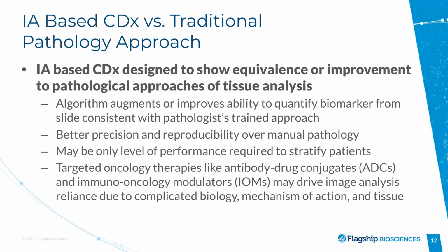Traditional pathologists don't really do as good a job as in the diagnostic work. Hence, in this era of personalized medicine, digital image analysis comes true. In truth, though, we have to keep in mind that these computer-based digital image analyses are still rooted very significantly in traditional pathology, in that they try to recapitulate the approach of traditional pathology, and the pathologist is involved at every step of the way.